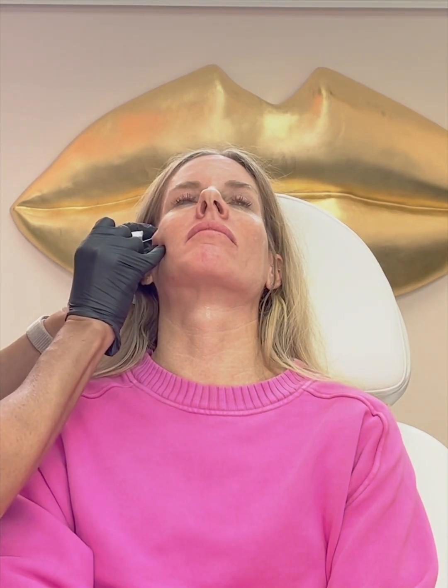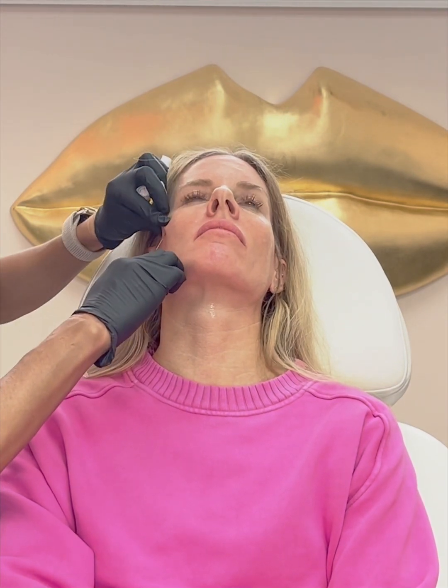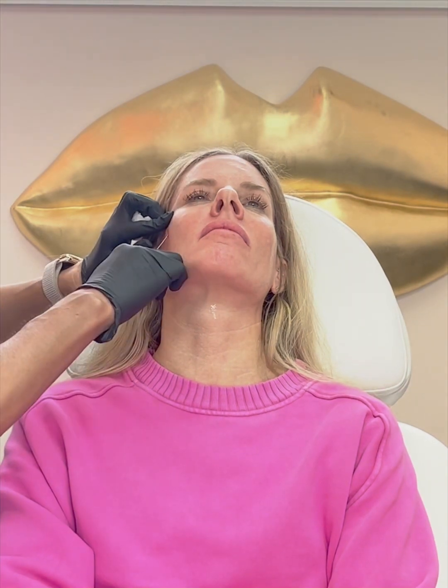I'm creating what's called a pilot hole with a little bit larger gauge needle than the cannula, and then I'll thread the cannula through this hole and into the desired areas of treatment. So with Sculptra, we are focusing on staying in the SMAS layer. We don't want to be too deep, and we definitely don't want to be too superficial with this product. It is completely different than your hyaluronic acid based products.